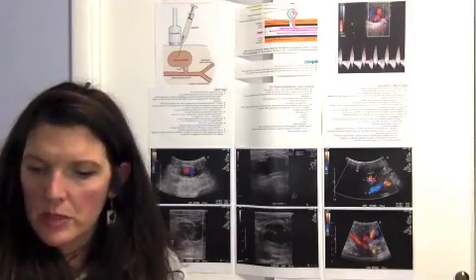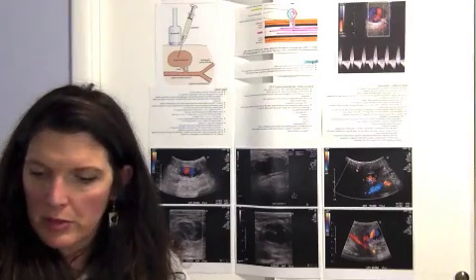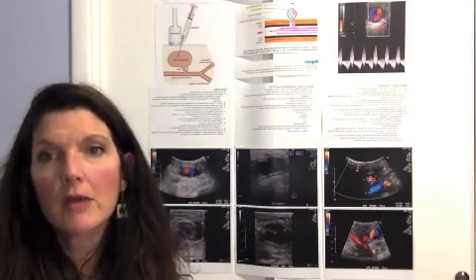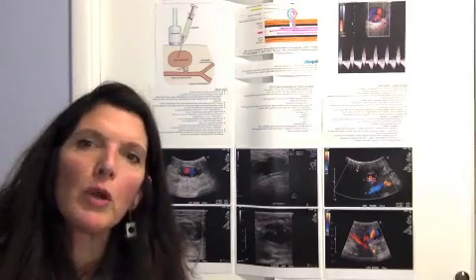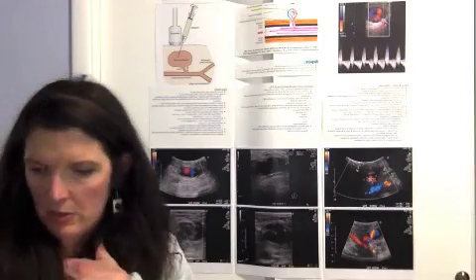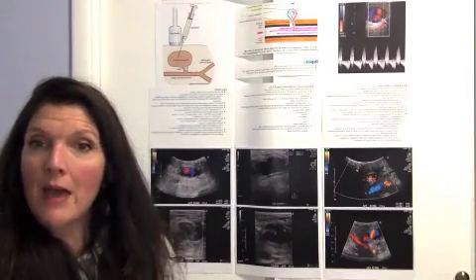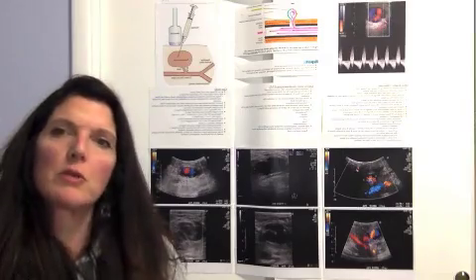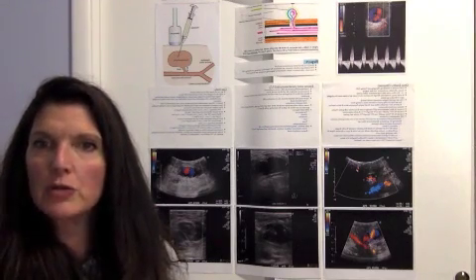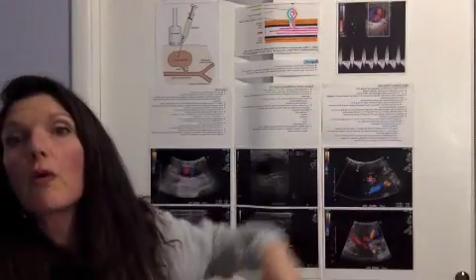Groin duplex ultrasound is the gold standard for identifying, managing, and treating pseudoaneurysms. This is because it's simple, affordable, non-invasive, and has real-time imaging. Typically, you want to use a 5 to 10 megahertz transducer with high resolution, and you want to do a B-mode sweep, looking for a mass and looking for echogenic debris and thrombus. And then you also want to use your color and your spectral Doppler to look for the yin-yang sign that we mentioned earlier, and the to and fro flow in the neck.